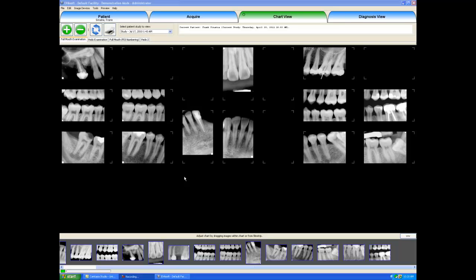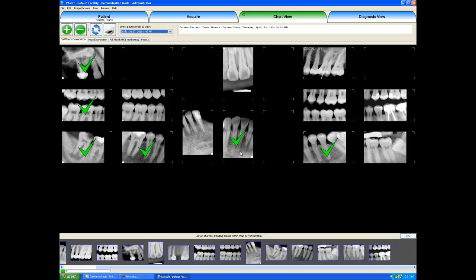To get to the Diagnosis View, we start at the Chart View and we single left-click the images to select them — the images that we would like to look at in the Diagnosis View tab. I will single-click my images to select them, and when I am on my last image, I will double-click it.